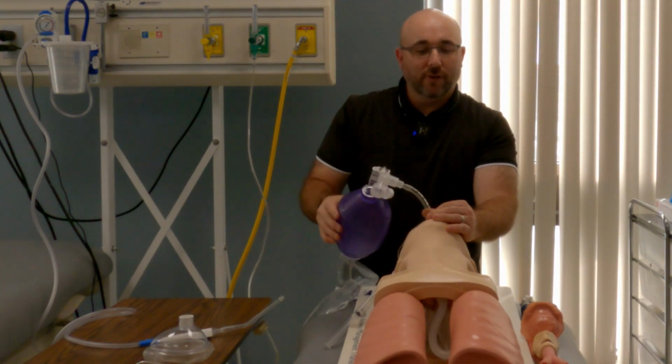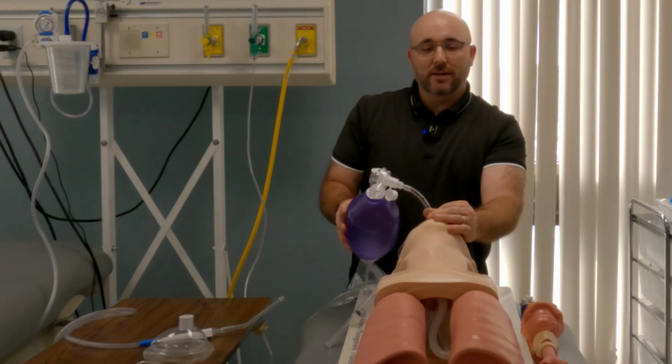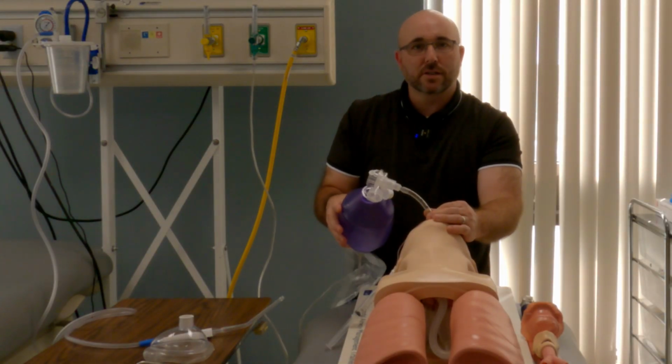Now, this is a beautiful case because we don't have to use a stethoscope because we can see the lungs expand, but our patients are not usually in this condition where both lungs are exposed.